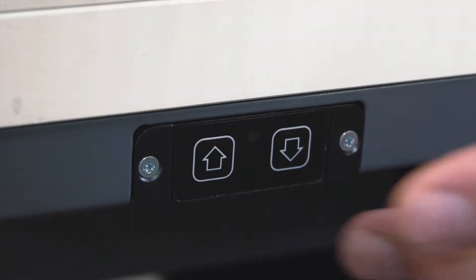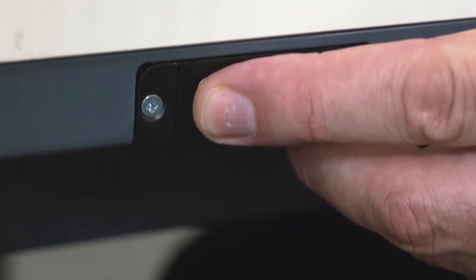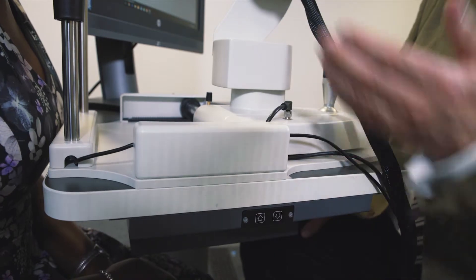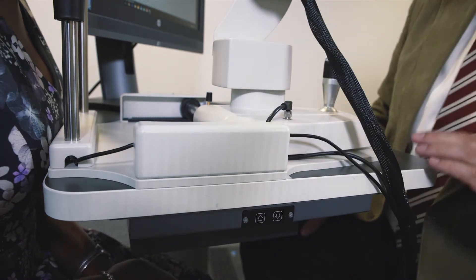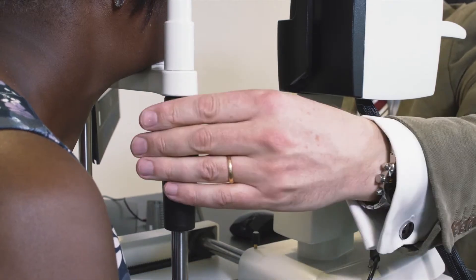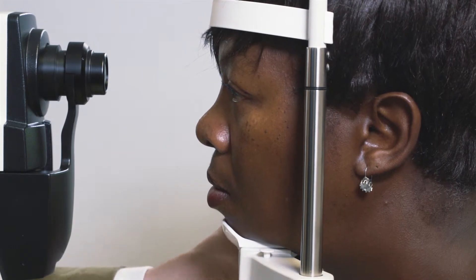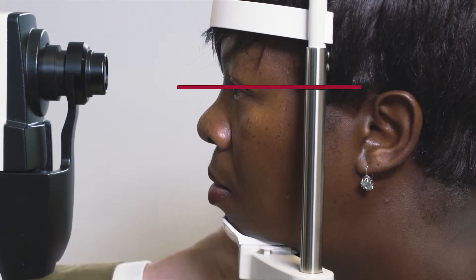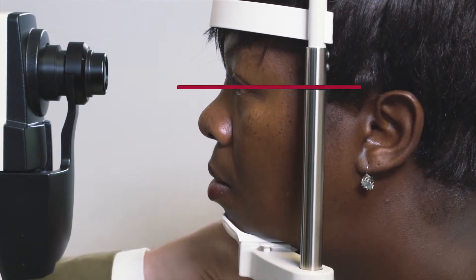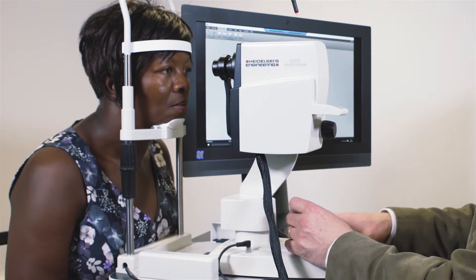The table height and chin rest position should be adjusted to ensure a comfortable patient position. The outer canthus of the eye should align with the marker on the headrest. The patient should be instructed to look at the blue fixation target, which is in the shape of a cross.